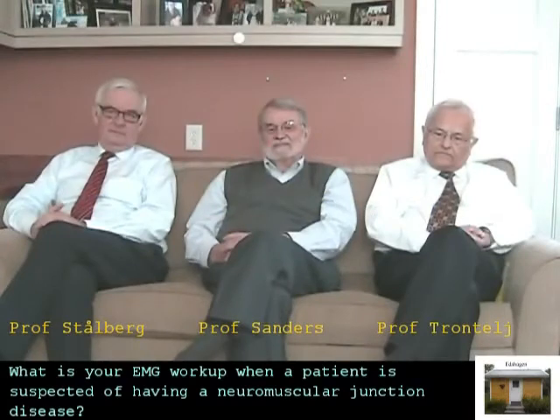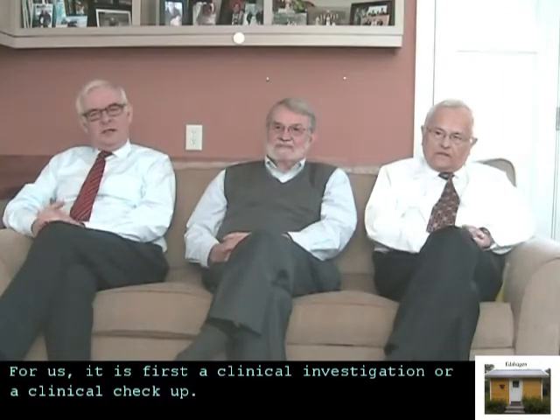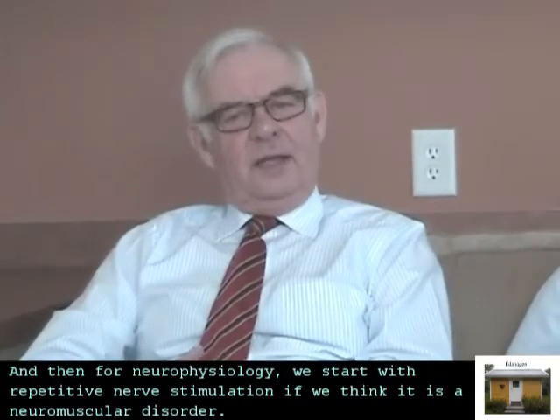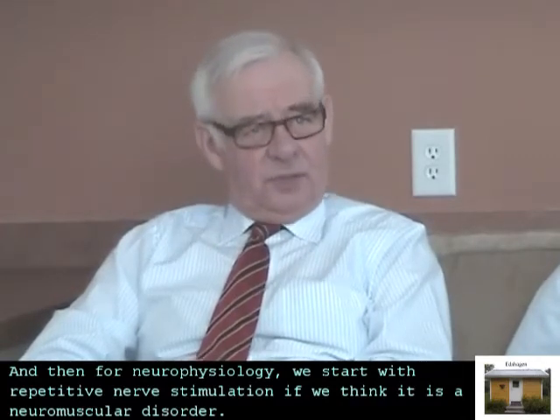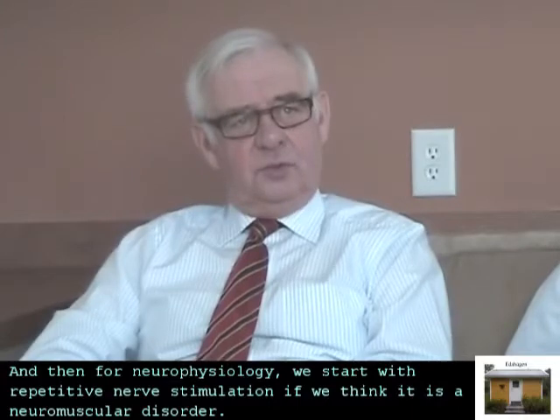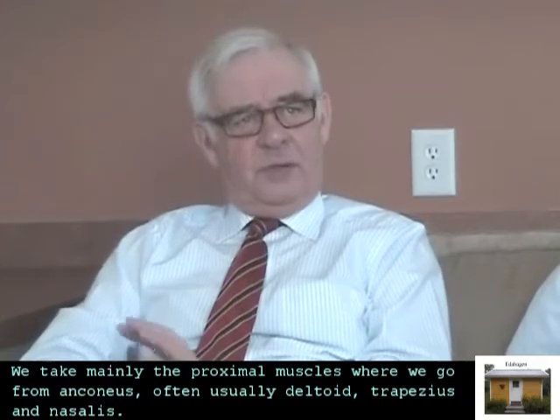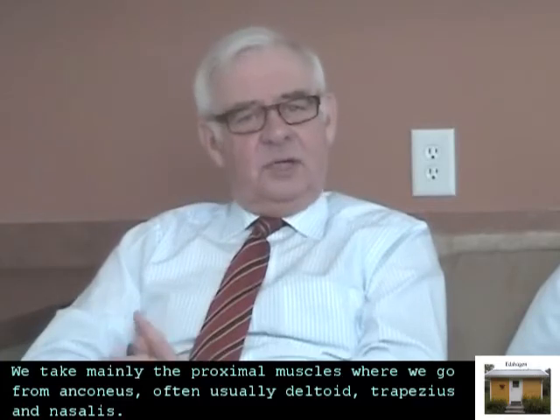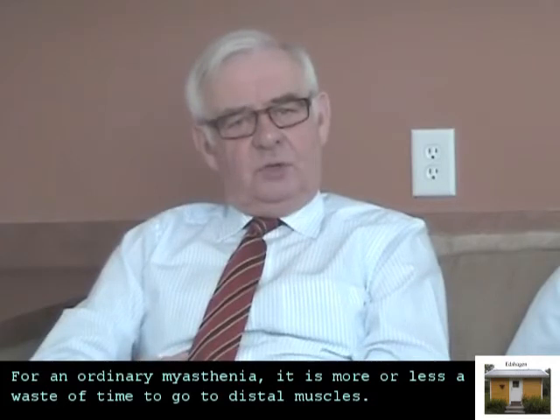What is your EMG workup when a patient is suspected of having a neuromuscular junction disease? For us, it is first a clinical checkup, and then for the neurophysiology, we start with repetitive nerve stimulation if we think it's a neuromuscular disorder. We take mainly proximal muscles, where we go from anconeus, often, usually deltoid, trapezius, and nasalis. For an ordinary myasthenia, it's more or less a waste of time to go to distal muscles.